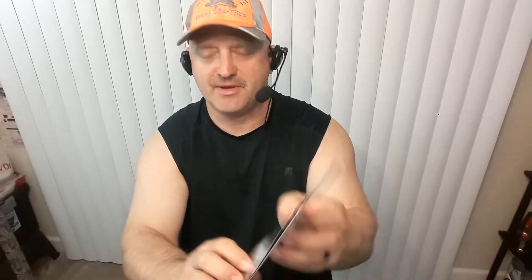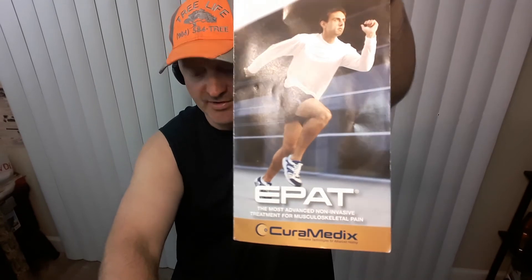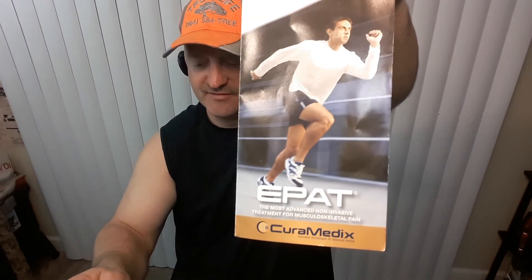Like I said, I've tried everything — massage, stretching, light laser therapy, which is good. You can use these in combination, but if you want to go in there and just knock it out and not have any surgeries, I highly recommend the EPAT. And if you're in Jacksonville, Florida, you can go to First Coast Foot and Ankle Clinic.